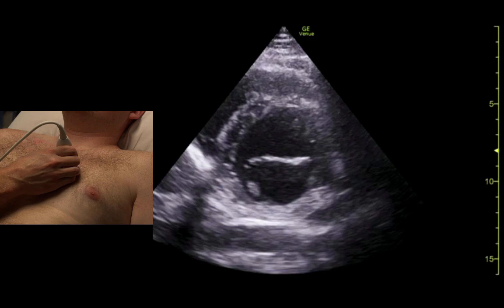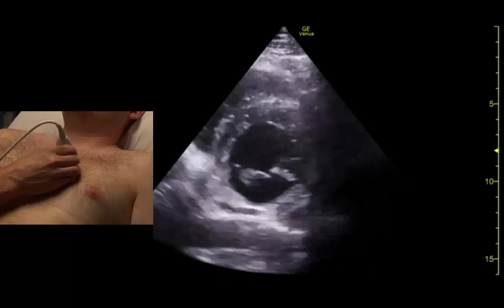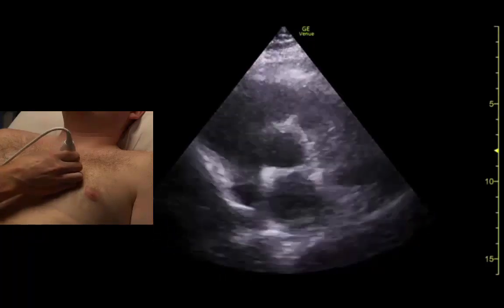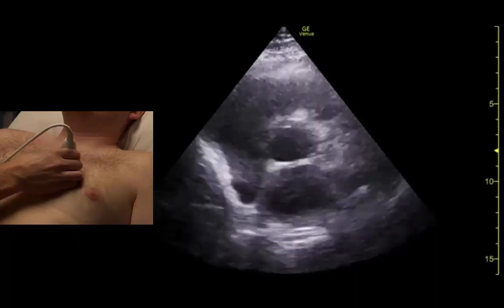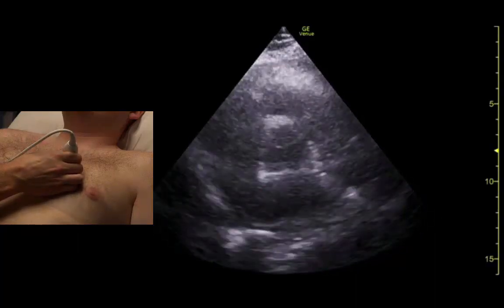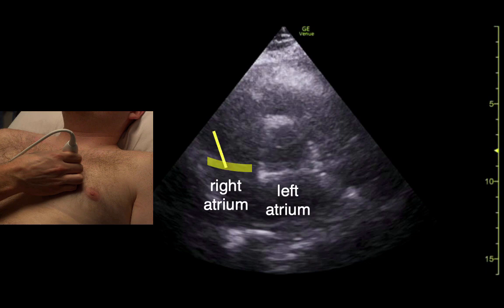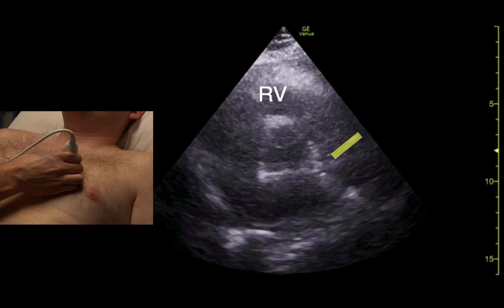We can fan in towards the sternum to get a view of the aortic valve in cross-section.